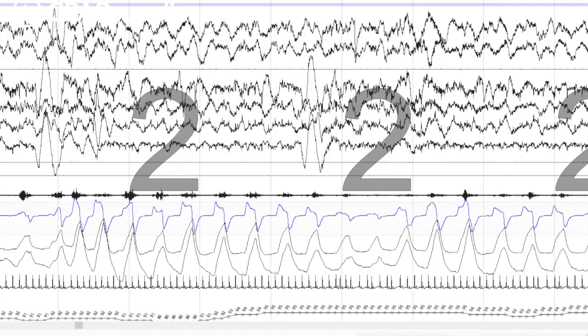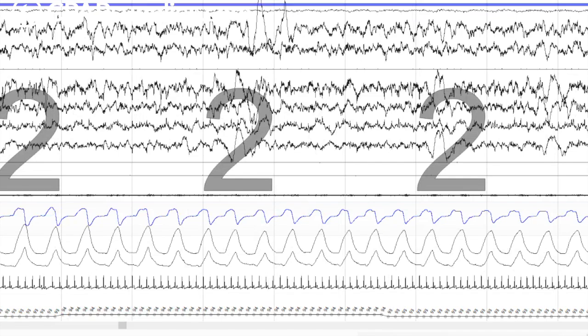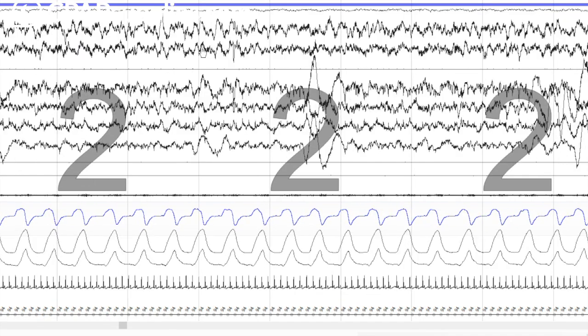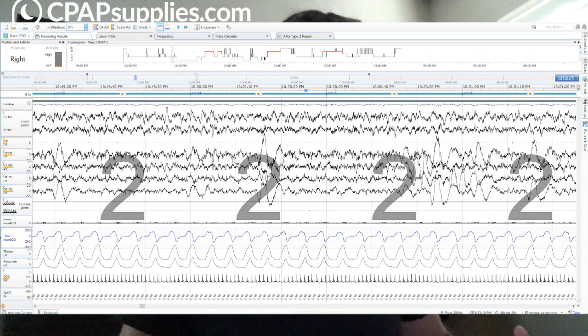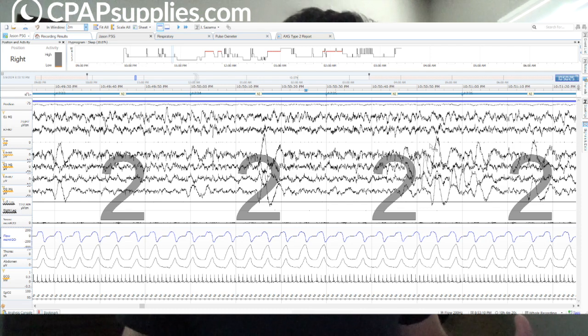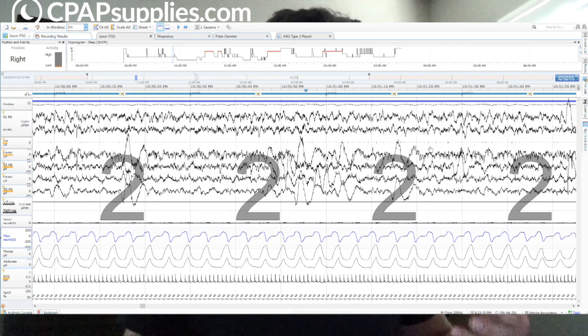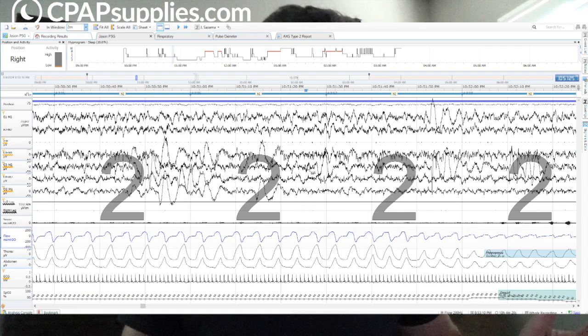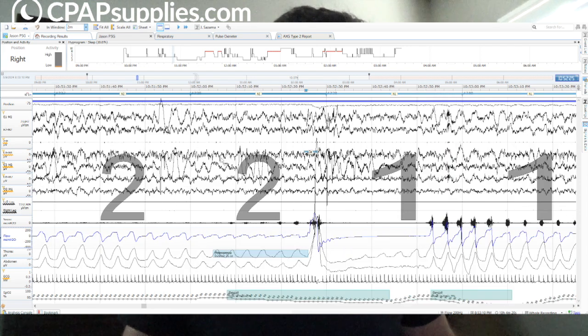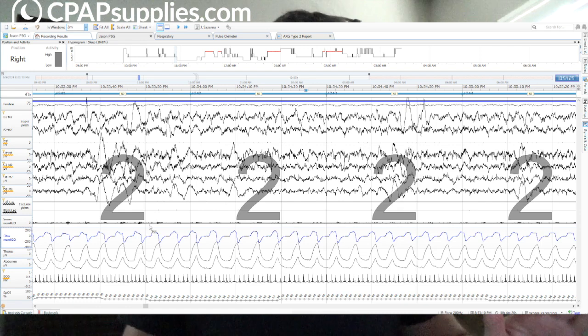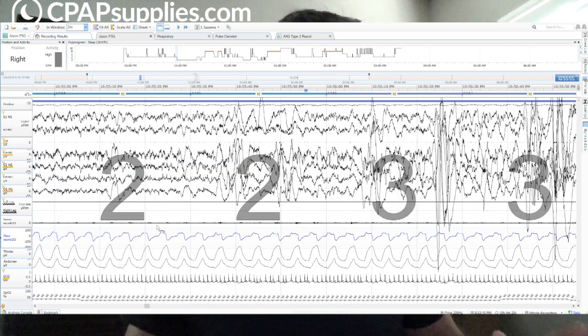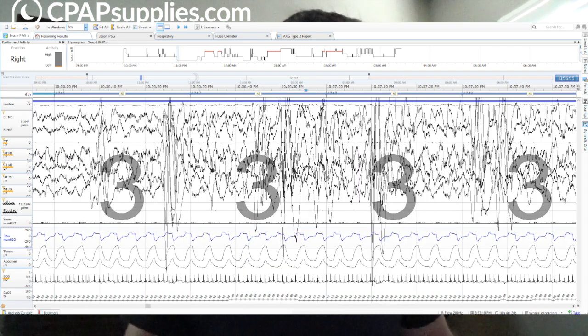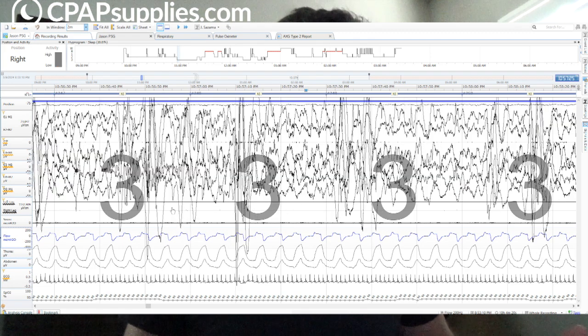So let's go ahead and move faster. I want to get up to delta sleep, stage three sleep. So do you see these massive delta waves? They're not enough. It has to be like 20% of the page, which is like six seconds worth of delta activity. You're going to see a little shift here. Just ignore that. So look at this. All of a sudden, we have these massive slow waves. This is delta sleep.